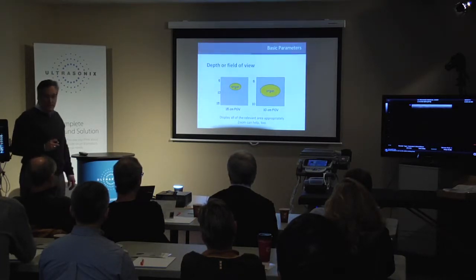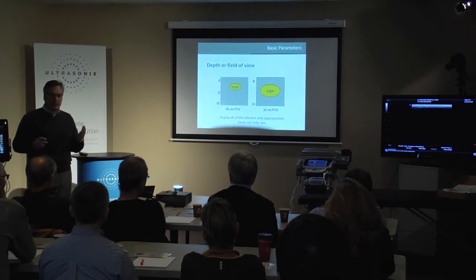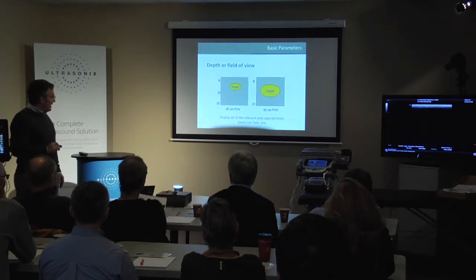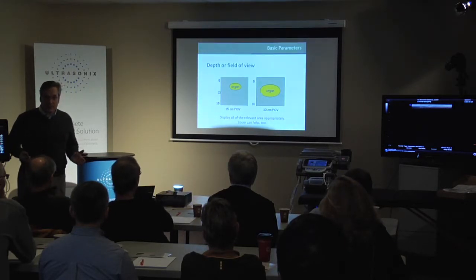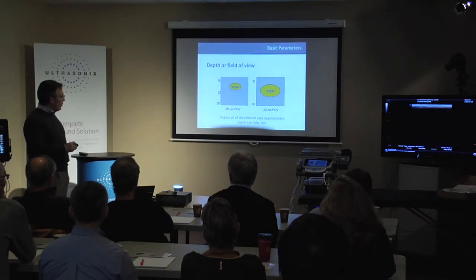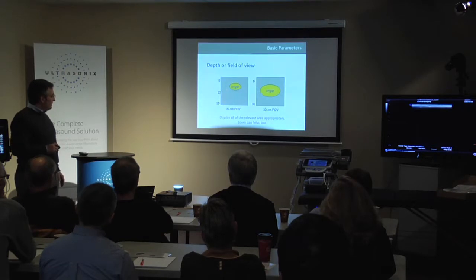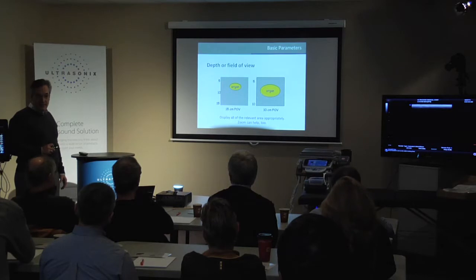I mention this because even in the radiology department, when, for example, there was a AAA being assessed, and the AAA was actually on a very short or shallow field of view, and the individual read the AAA as a positive AAA, which in fact it wasn't. So sometimes look at your depth of field to say, well, that's large or that's big, but it will correspondingly and appropriately size down the organ or area of interest in your image exam field.